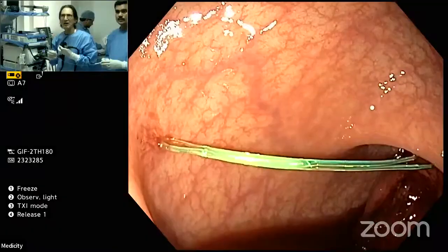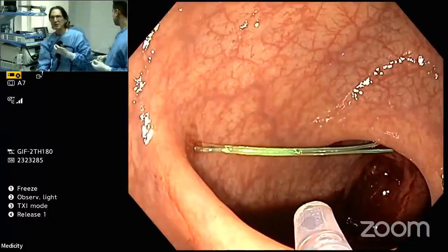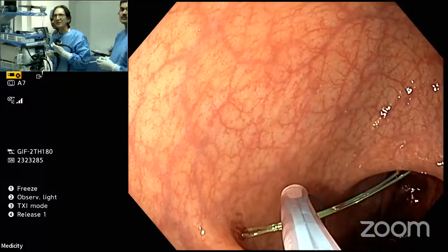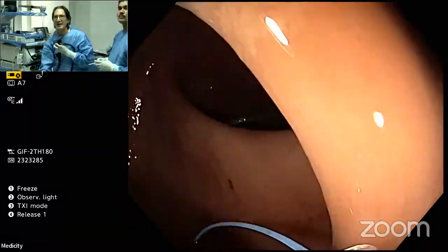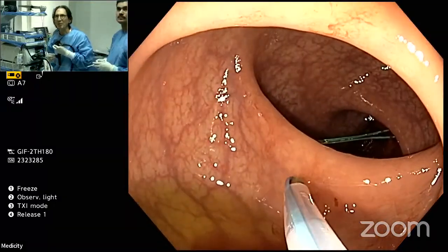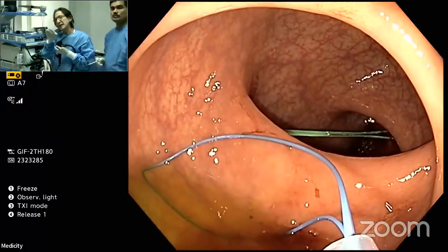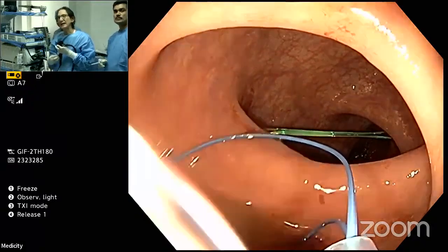So you see here, I'm going to advance this out. Open the loop, please. So this is the Olympus loop. The problem, though, is it's very floppy. Is it already open? So you see how it's already flopping down? And one of the problems that we encounter, open the loop, please, all the way, is that when you start to close the loop, the tip flips up. And then it's not actually going to stay flush up against the wall.